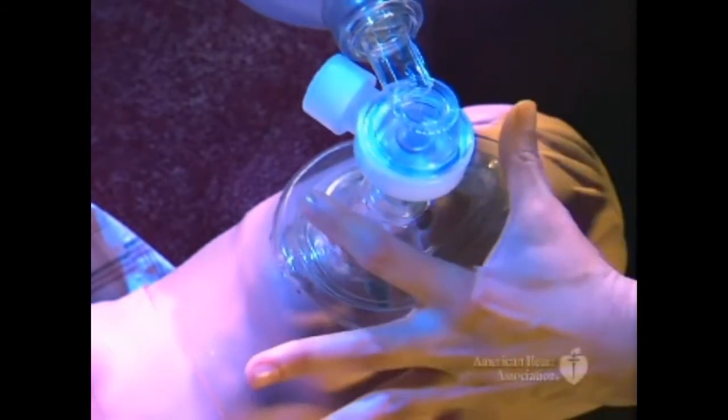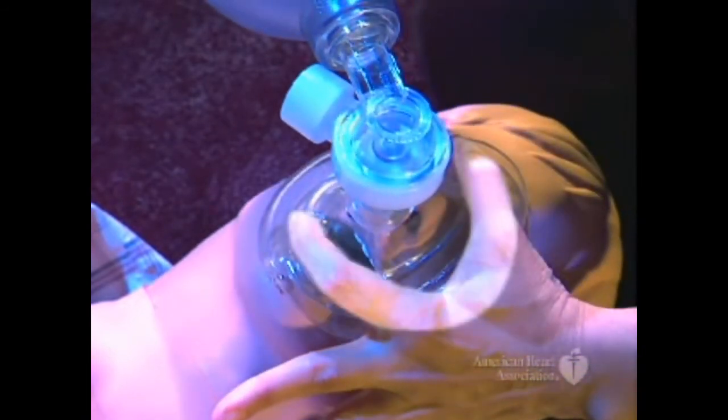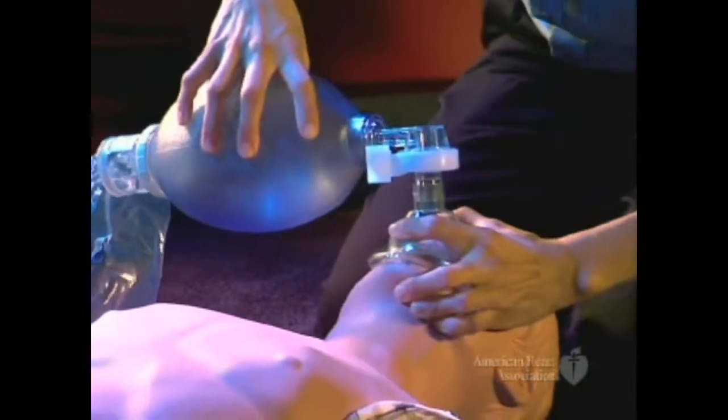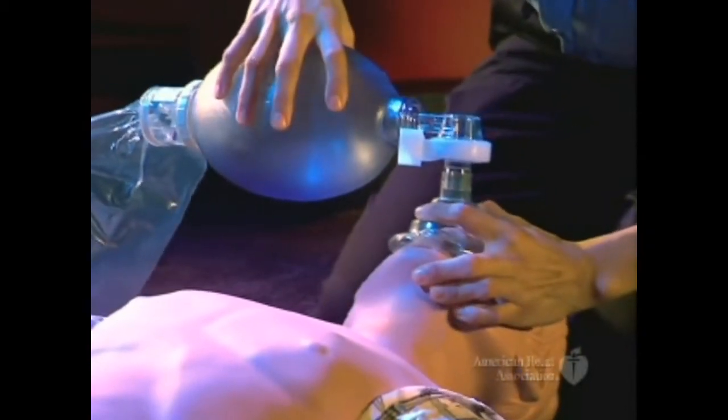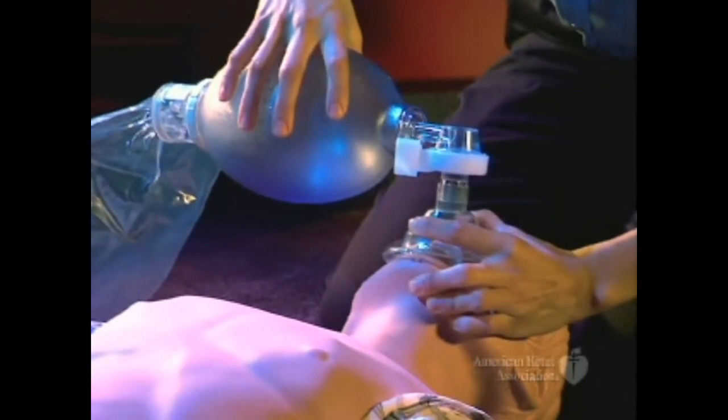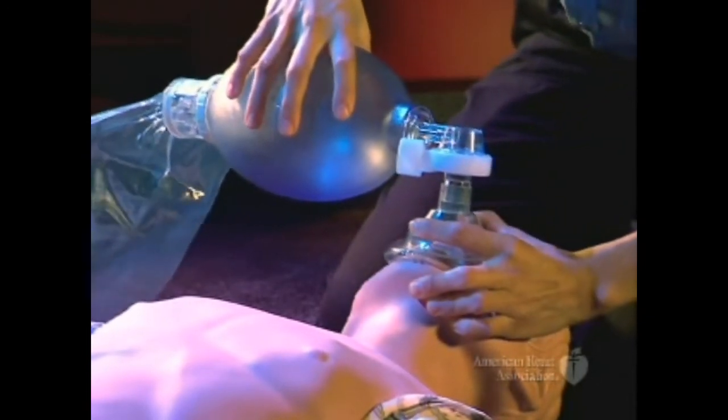Use the thumb and index finger of one hand to make a C to press around the edges of the mask. The remaining fingers of your hand should form an E to lift the angle of the jaw and open the airway. Make sure you squeeze the mask with your thumb and the heel of your hands while lifting the jaw to achieve an airtight seal.